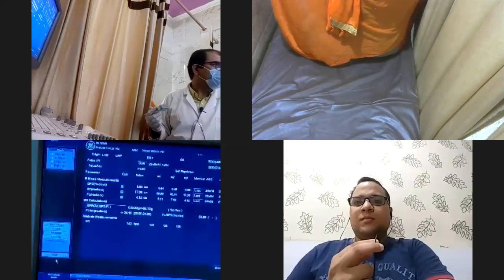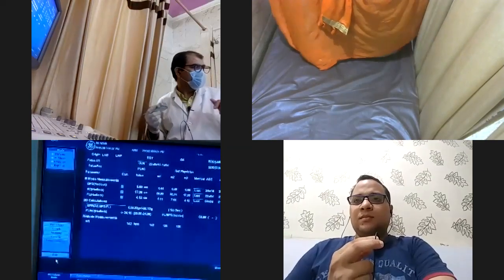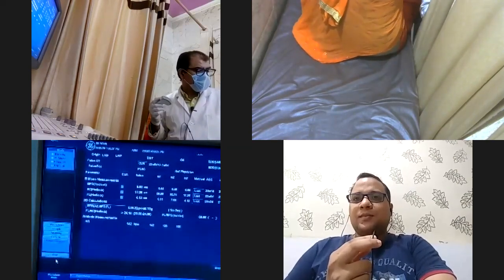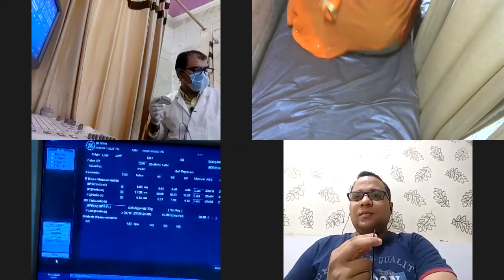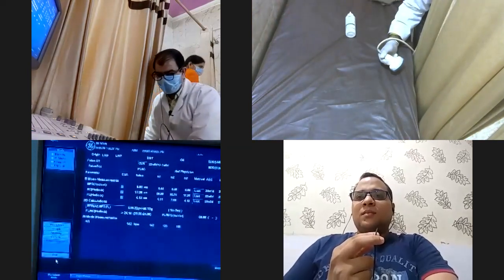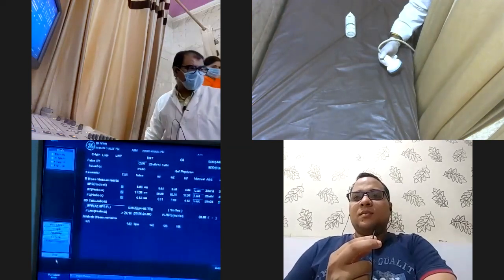So now, Dr. Saurabh, we are starting the first session with you. First session, interactive first session, I mean. You are already taking the physics and machine settings with us, right? Yes, sir.